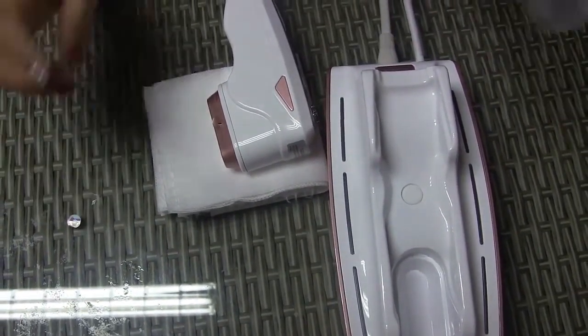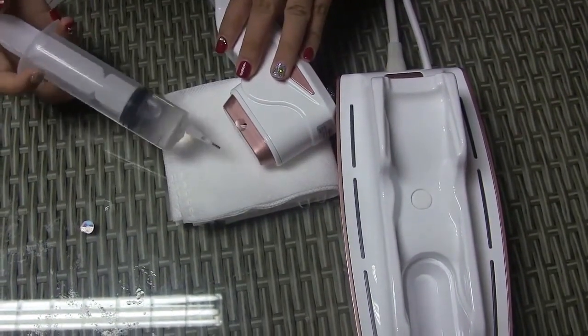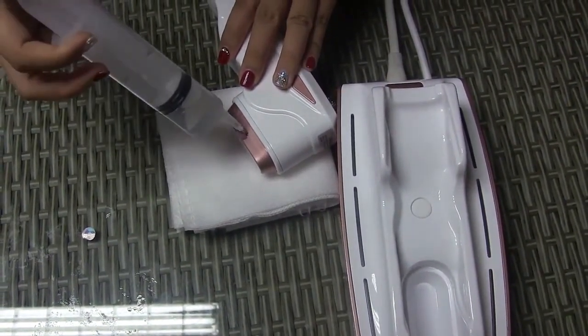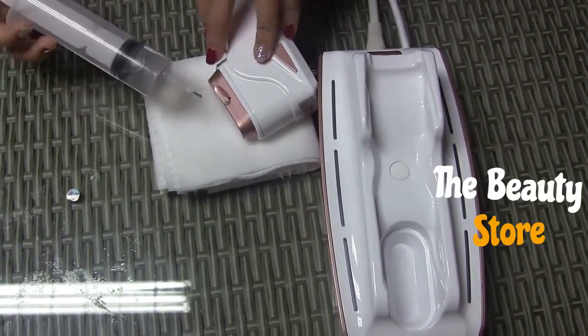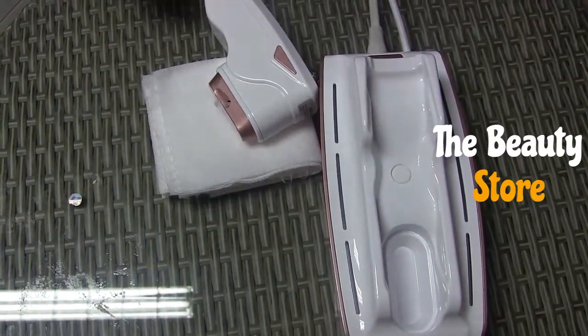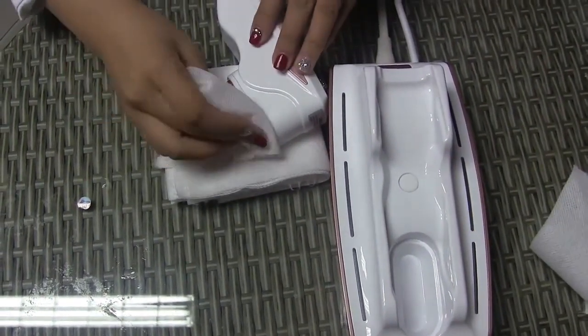And we're using the purified water. And you can see the water in this way. When the water falls from this hole, that means the water is full. And then we wipe off the water.